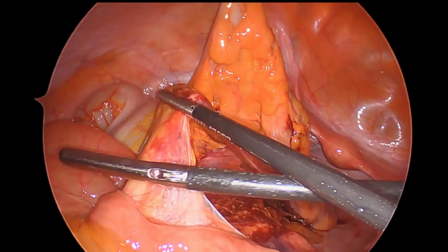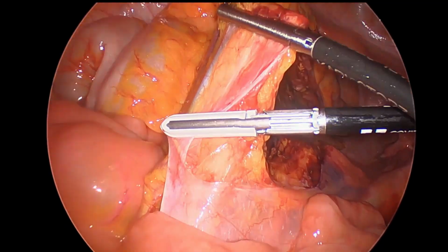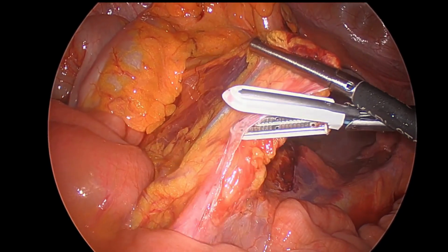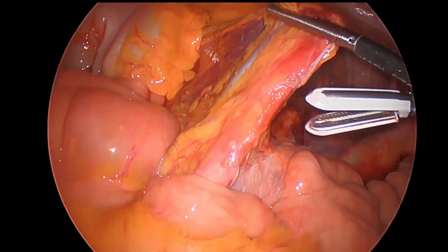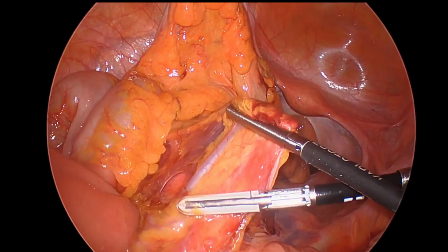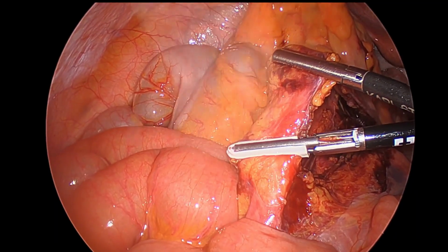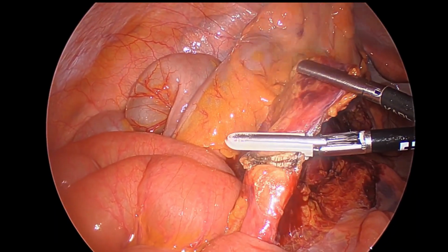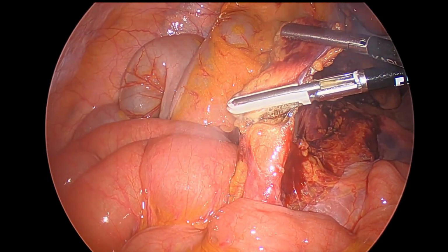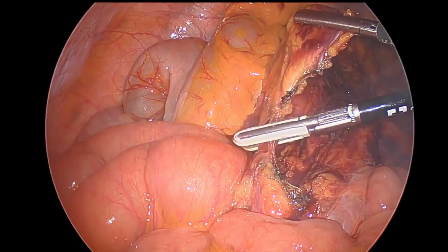So now we're going to take the vessel, we're taking the peritoneum over top of it. I just want to point out that here we're not doing a high ligation, we're taking the pedicle just distal to the left colic takeoff. There's no real oncologic benefit when doing a low anterior resection of taking the IMA pedicle, but of course it's very important that one consider taking the IMA pedicle flush with the aorta, or just distal to the aorta, if you really want to gain maximal length on the colonic conduit. That's my tip about go low to go far.